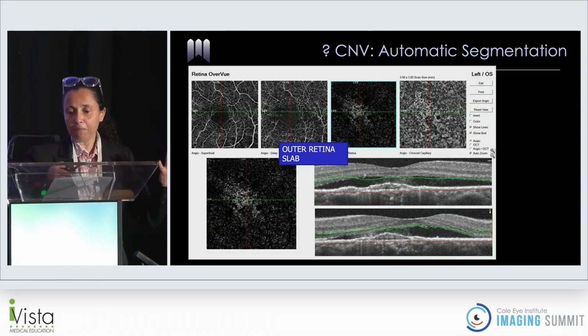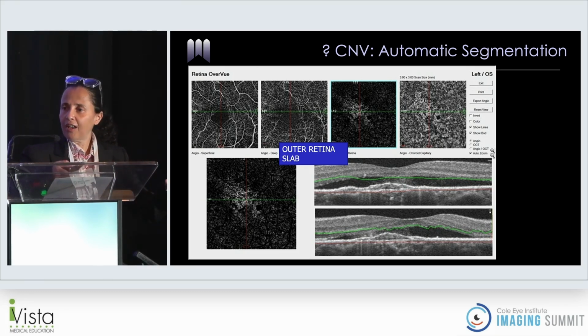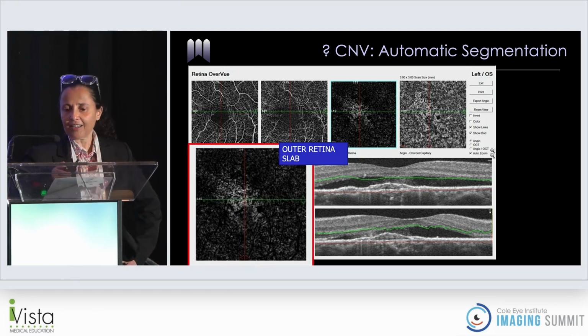So here's an example of a patient where I was convinced there was a CNV, there's subretinal fluid, SHRM, a PED that looks fibrovascular. But the OCTA shows this smudge. I was expecting these beautiful networks of vessels. It looks like a smudge.